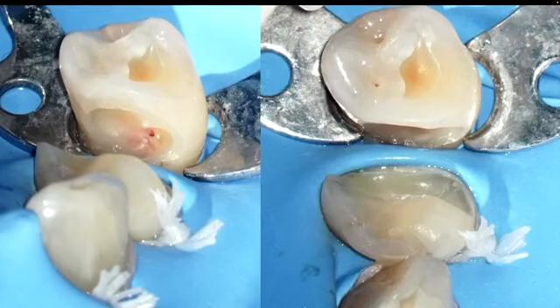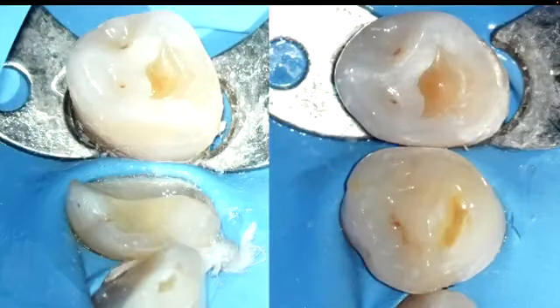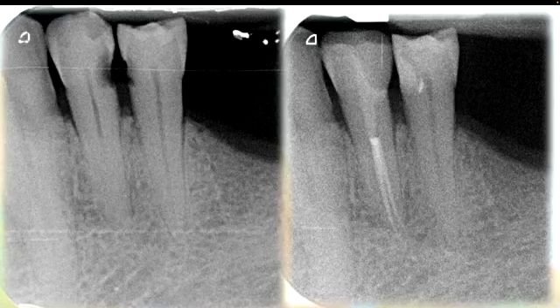And then you can see that I also had to do a direct pulp capping on the second lower premolar. So what did I do? I finished root canal therapy. I did the build-up of the first premolar, took an impression, and I called the patient back some days later in order to manage the direct restoration of the second premolar with the direct pulp capping, and in order to do the cementation of the onlay I did on the first premolar. So as you can see, I did the direct restoration, and there is the onlay. And this is the final X-ray.